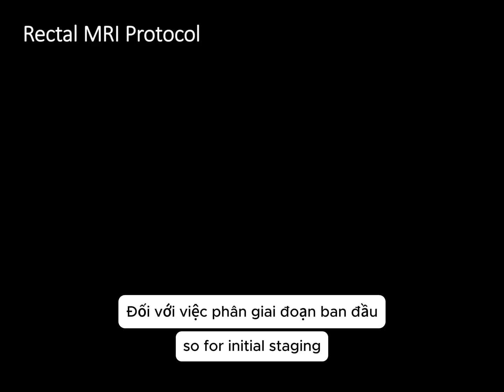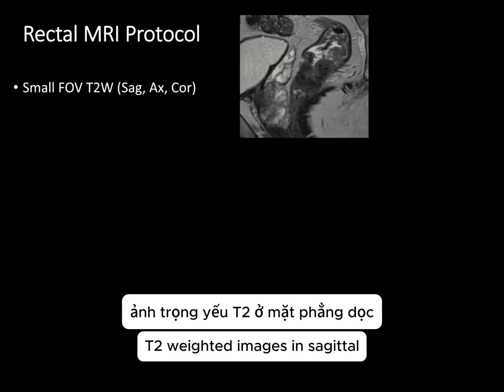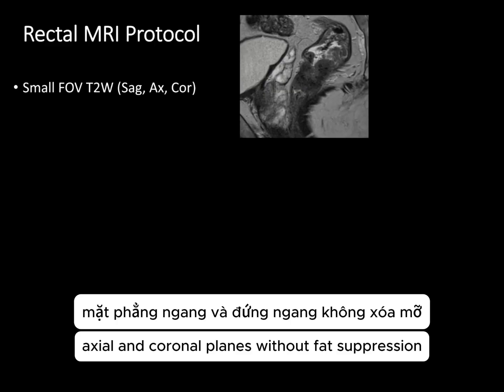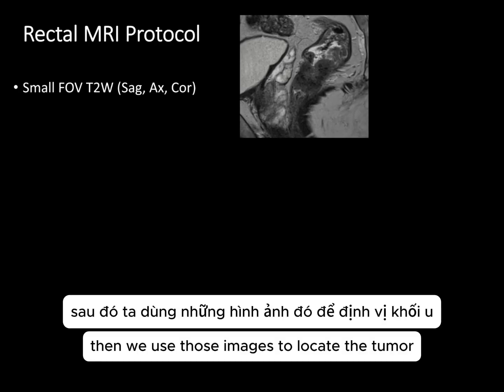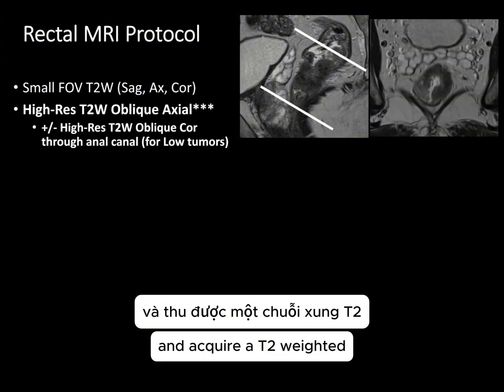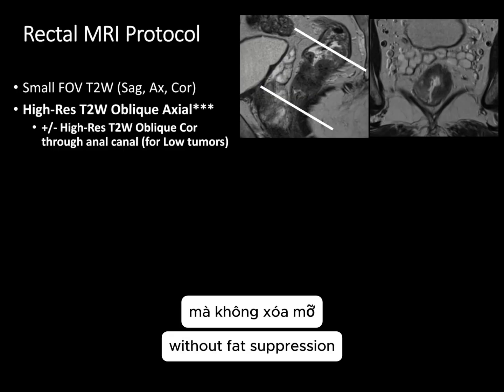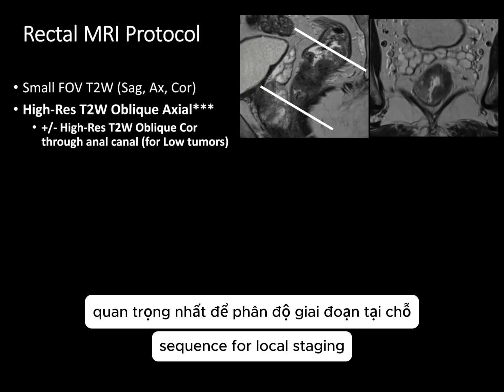So for initial staging, our standard MRI protocol includes small field of view T2 weighted images in sagittal, axial, and coronal planes without fat suppression. This is the sagittal T2 weighted image here. Then we use those images to locate the tumor. So for example, you can see the tumor here in this patient and acquire a T2 weighted high resolution oblique axial through the tumor itself without fat suppression. This is the single most important sequence for local staging.